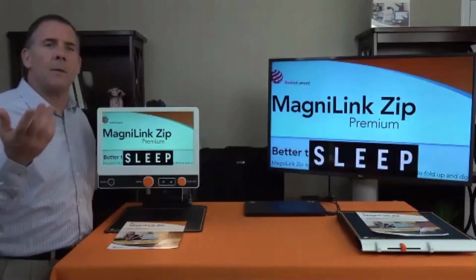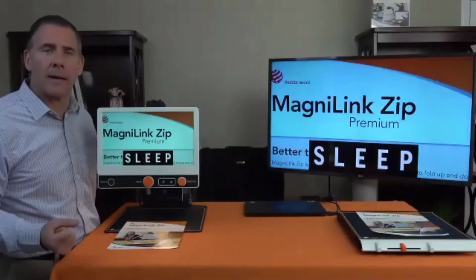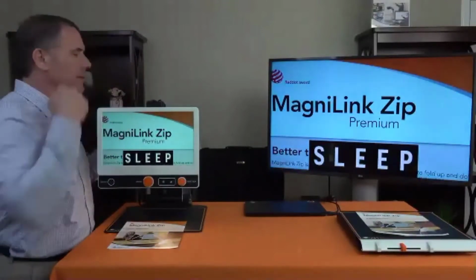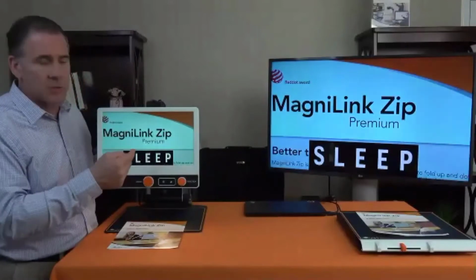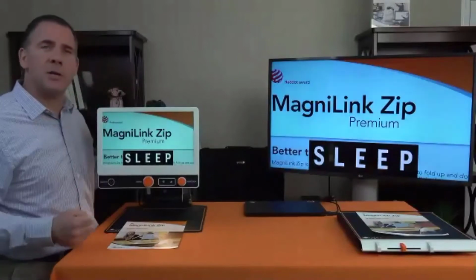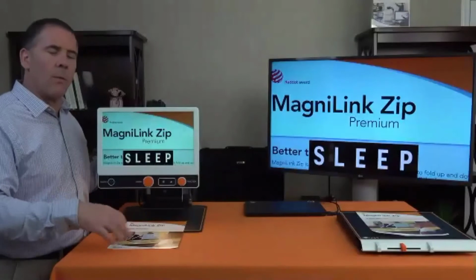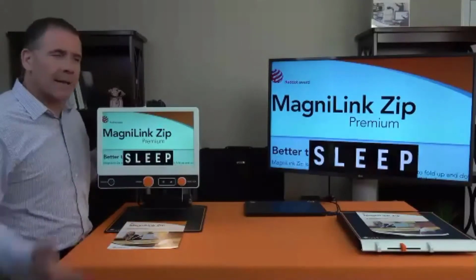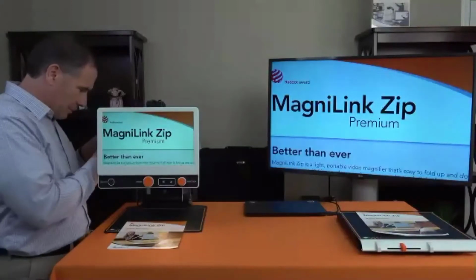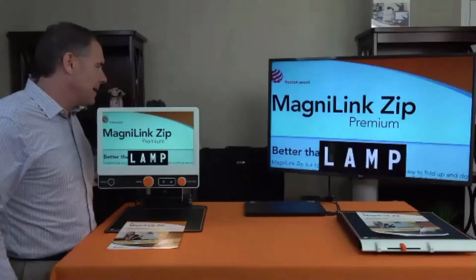Sleep is huge. The battery in the Zip goes for 5 to 9 hours. I'm running everything on battery right now. 5 to 9 hours. How do I get more than 5? I activate sleep mode. What does that do? It shuts the screen off and the light off, two of the big draws on the battery. But it leaves the machine on. So when I come over and move my hand or move the paper, I activate the unit and it's back up and running. And now I didn't touch it. If you don't mess with the menu, it goes to sleep on my lamp.